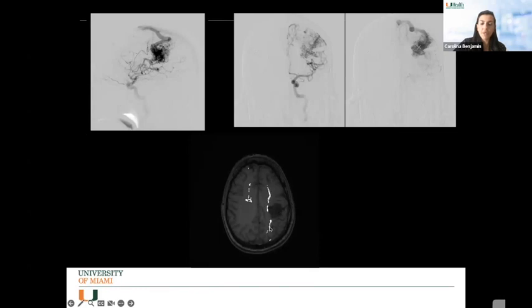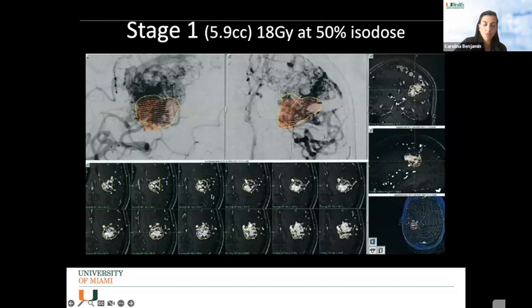And this is a DTI showing us the corticospinal tracts just medial to a portion of that AVM. You don't even see the motor strip here, but this is essentially where the motor strip is. So I'm concerned that if this person has an adverse radiation effect, they're going to have significant impairment, possibly be completely weak on the contralateral side. So this is concerning, and I use this to guide my conversation with the patient in the office.